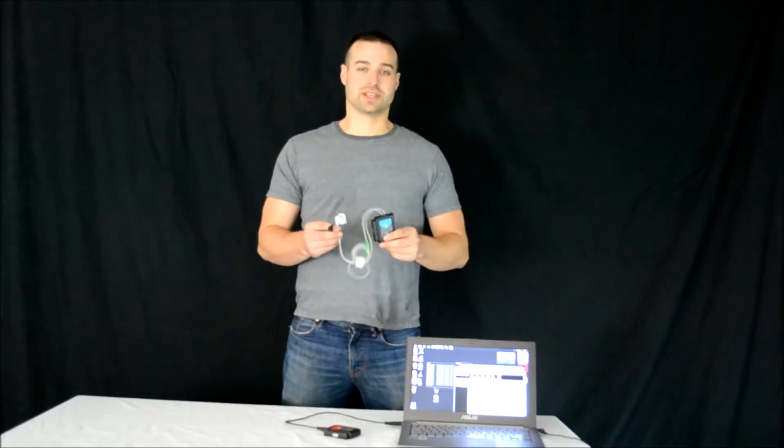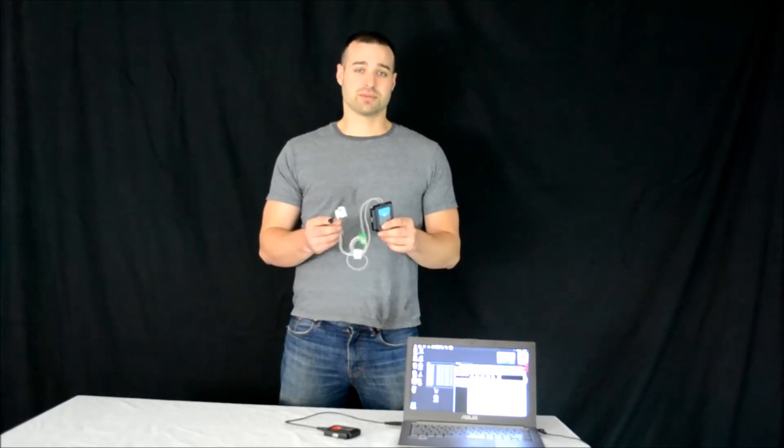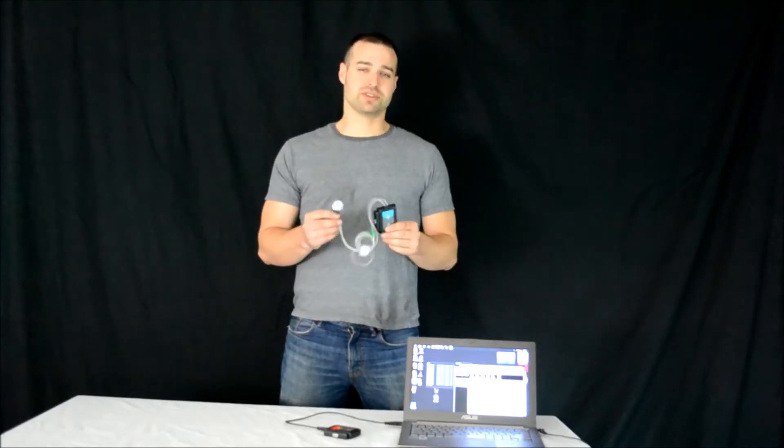Today we are going to demonstrate the NuLog Galvanic Skin Response Sensor. First we are going to talk about some of the technology it uses, then we are going to talk about some of the common experiments GSR sensors are used for.